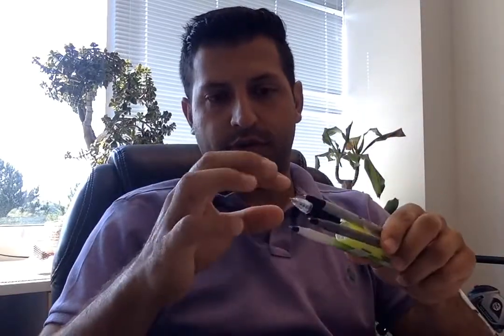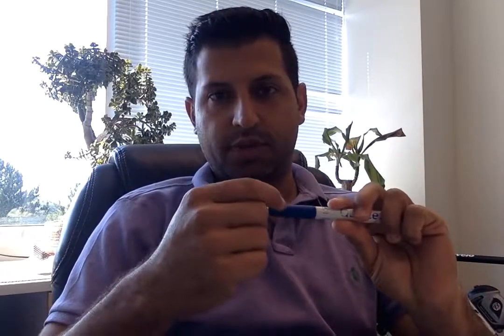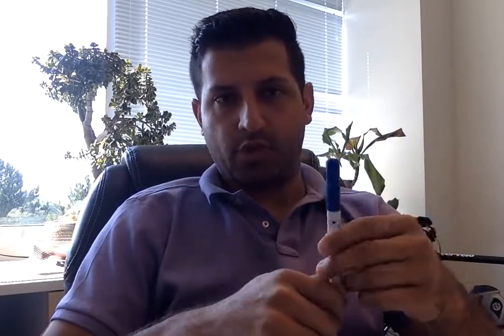And what people use is basically multiple electrodes very closely spaced. So it could be multiple electrodes twisted, so microwires that are twisted. So you'll end up with 4 electrodes at the tip that are very closely placed. Or you may have a single electrode shank with multiple electrodes printed very close to each other on this one shank. So an example of this would be the laminar probes in the tetrode configuration. And the tetrode configuration basically means the 4 electrodes are very close to each other, so they more or less record the same neurons.